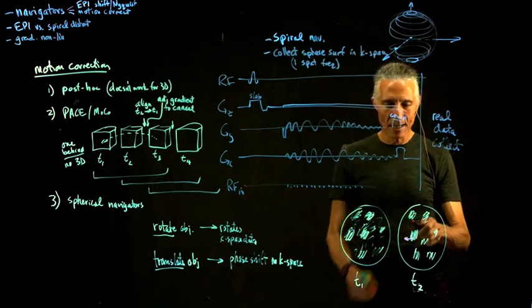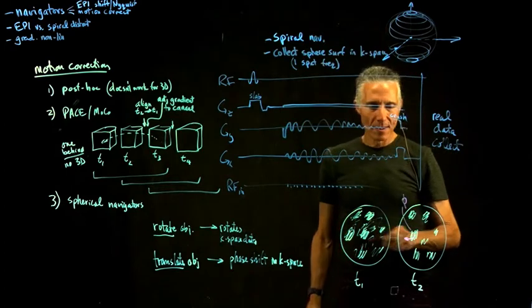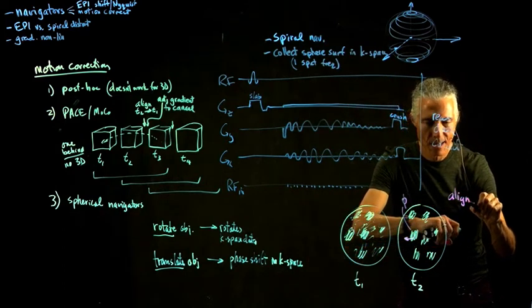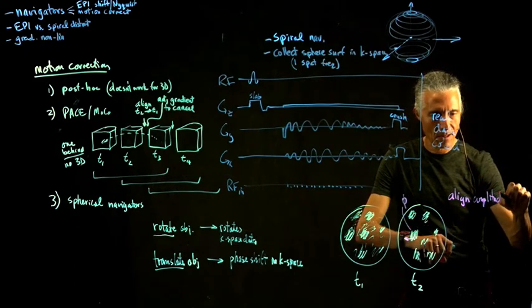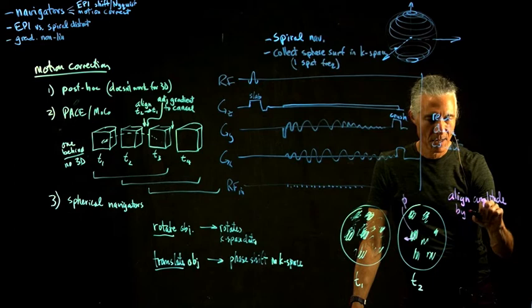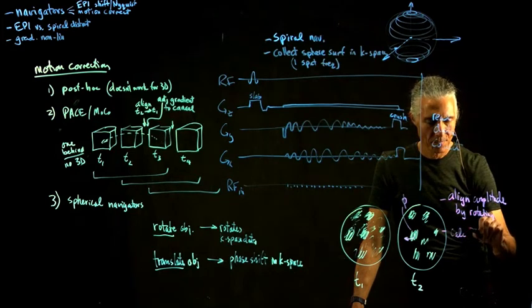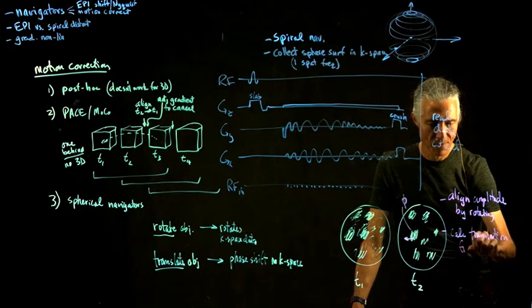And that tells you the rotation, and then look at the phase of that data. So this is just lining up the amplitude by rotating, and then calculate translation from phase difference.